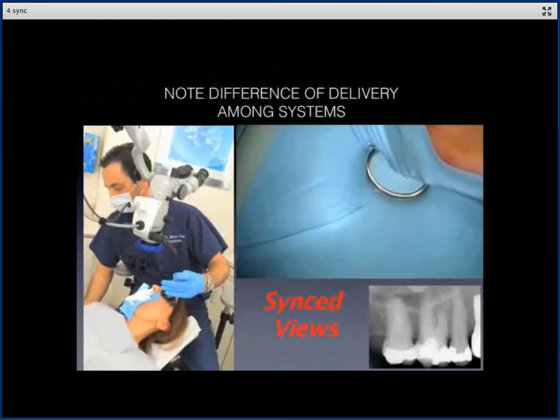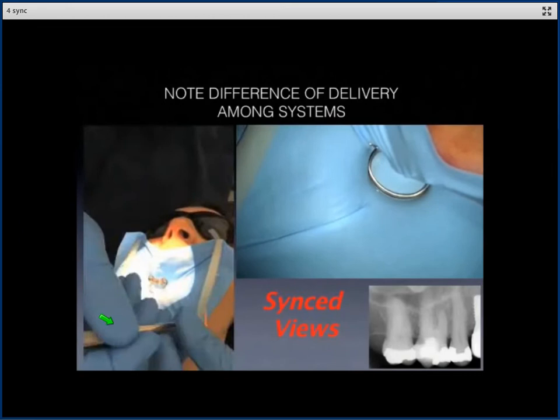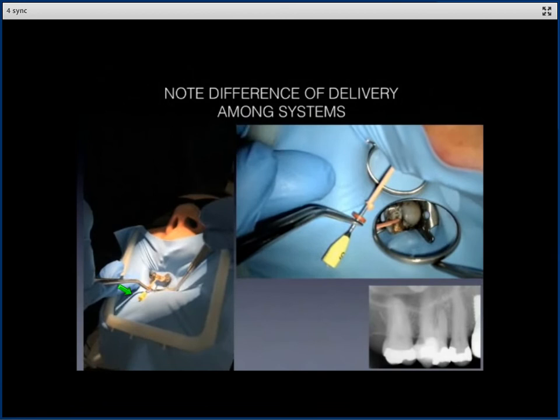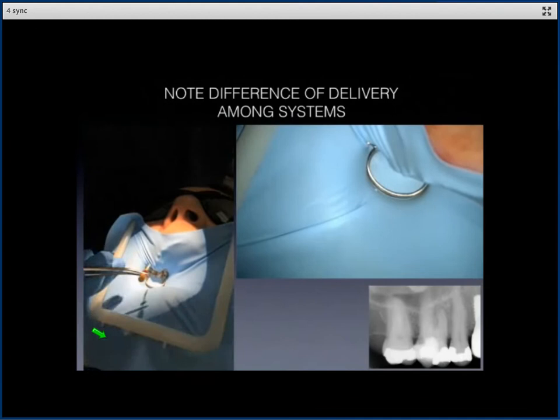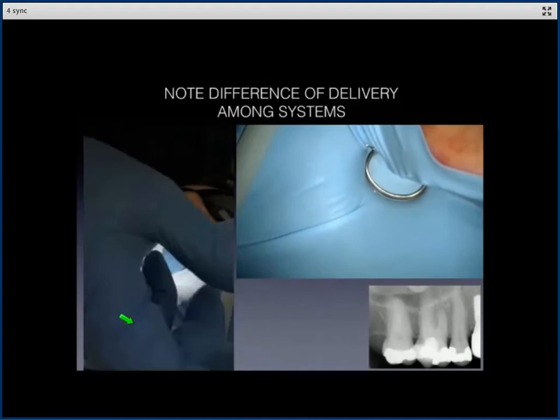Now we have this hot instrument. And keep in mind how over here, we have to be very careful not to touch the lower lip and the opposing arch. It's not that tough to gain access, but it's still something to keep in mind. This is a plastic-based carrier over here, but note how difficult it is to obturate, especially the mesial canals, because we've got the opposing arch in the way. And the same holds true for this other carrier-based obturator, which is a plastic carrier-based obturator, which was phenomenal for its time, but this was an issue. And this was a big issue for me and for many people, that it's very difficult to gain access, especially in posterior.